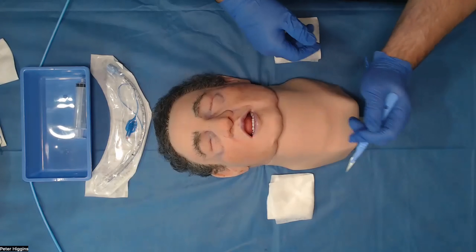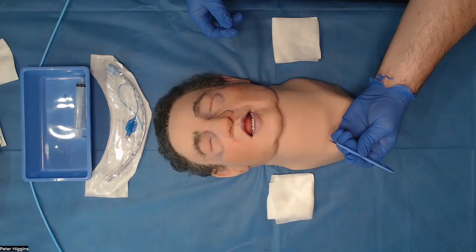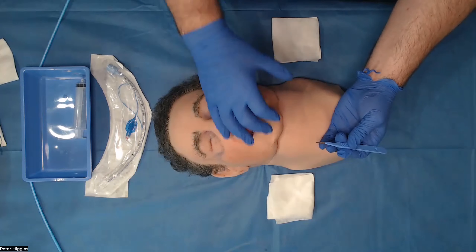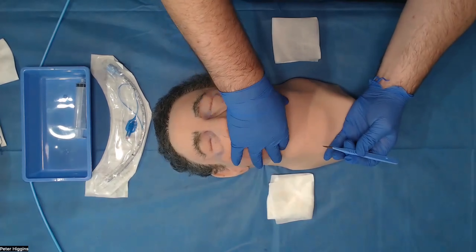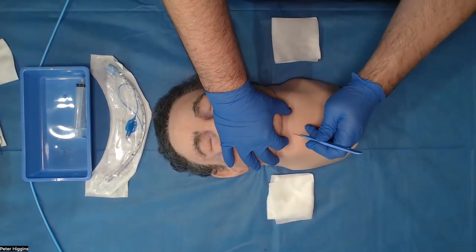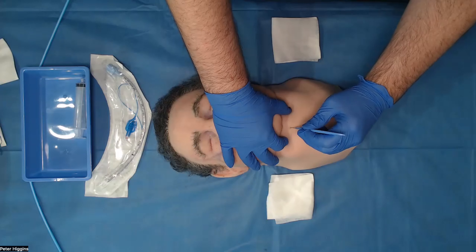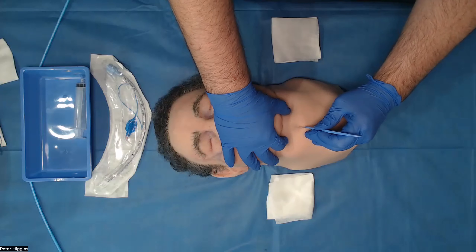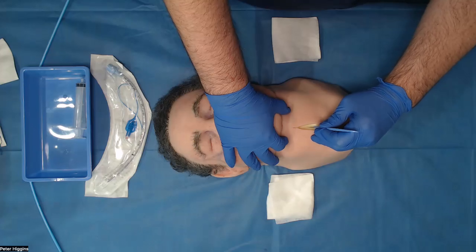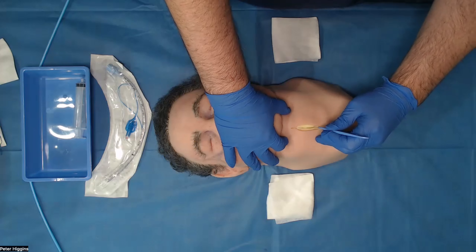All I can feel is fat. With the patient desaturating further and further, we're going to have to make the decision to cut the front of their neck. So using a scalpel here, going to try and find what I think is the middle — it's about here. Now I'm going to make my first skin incision here.